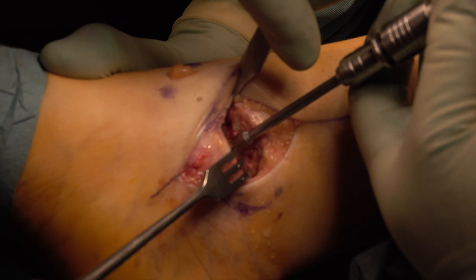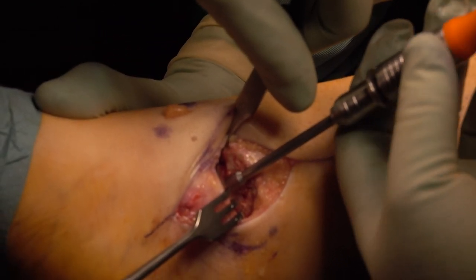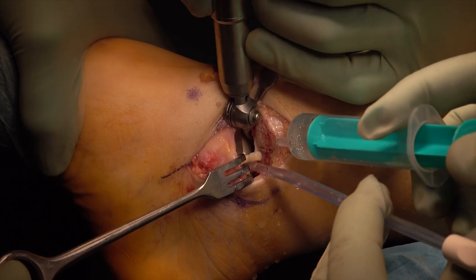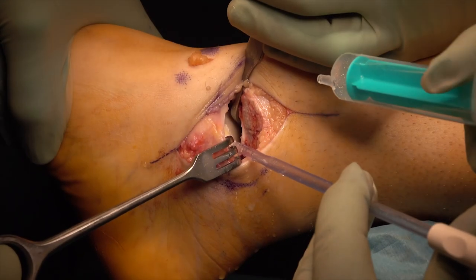We insert the shark screw to the planned depth of 22 mm, leaving part of the screw with the hexagon head standing out of the surface. With the oscillating saw, we cut off the screw above the cartilage surface.